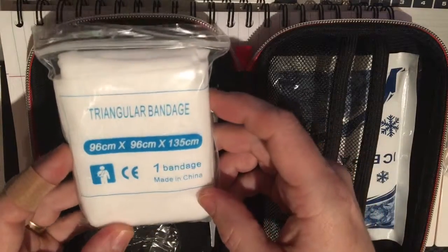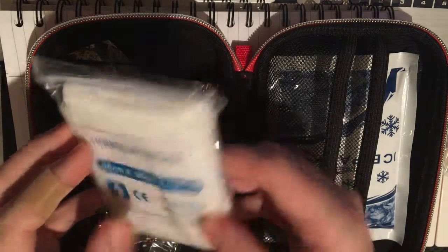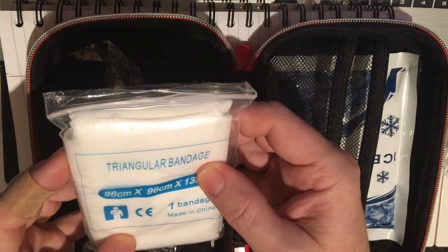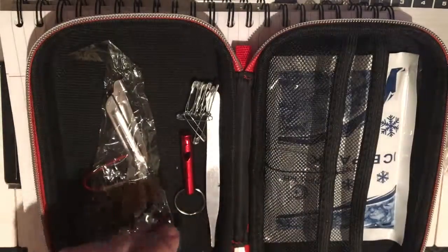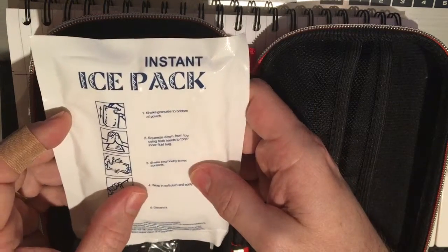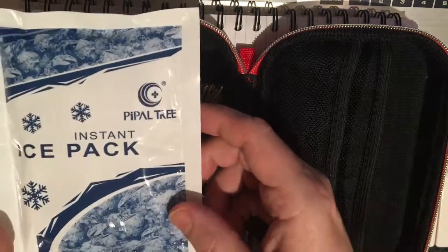We have a triangular bandage here — a pretty decent size, useful for larger wounds or you could use it for a splint like an arm splint. And lastly we have a chemical-type ice pack. You shake it, squeeze the chemical out, mix up the contents, and it turns cold. It's disposable after that.